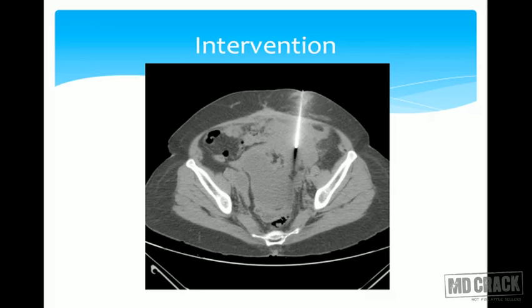So ultimately, what we realize is, it's not just the CT. There are different modalities to evaluate the abdomen, and each modality has its own merits. So barium is for when you look for mucosal disorders or motility disorders. Ultrasound can be a good examination to begin with. And then obviously you have the CT. CT will tell you a lot.